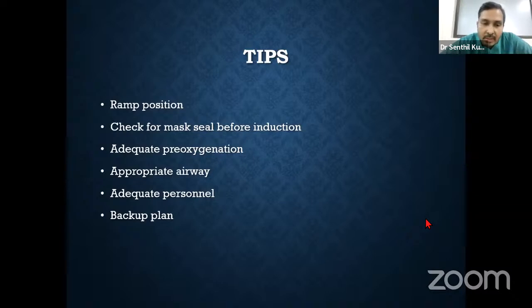Then adequate pre-oxygenation, and do all measures to increase the amount of oxygen reserve in the patient, like mask pre-oxygenating the patient with CPAP, head elevated laryngoscopic position, and if possible, additional source of oxygen supplementation through catheter during mask ventilation or induction. All those things are very important. Then choose appropriate size airway for the patient that has to be prepared pre-induction itself. Then the need of adequate help and backup plan is very important for successful management.